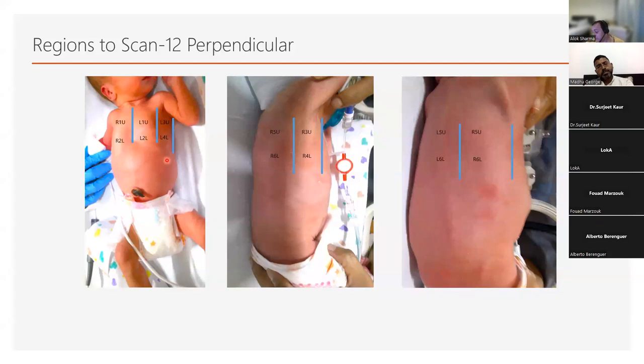If you want to use the 12-region method for everything, I have no problems. You can use it. You can have one linear probe, which basically lies and covers the entire anatomy. But you can say that's actually R1, R2. And my personal view is that's acceptable as well.